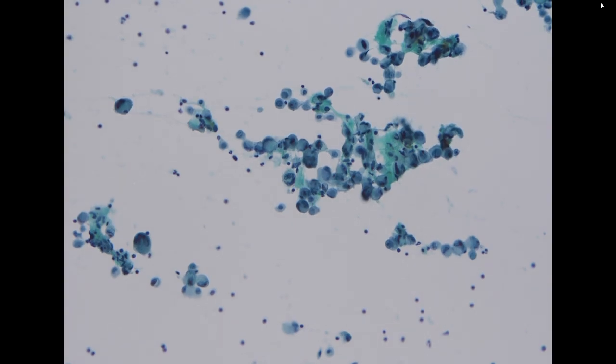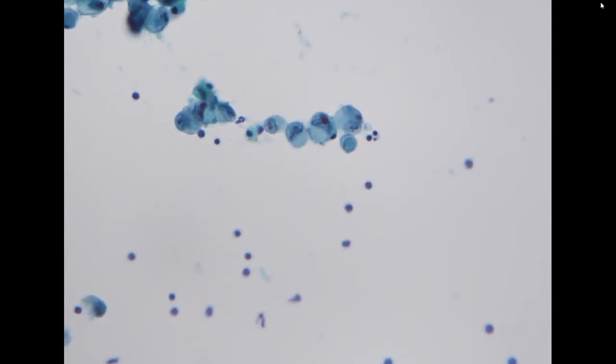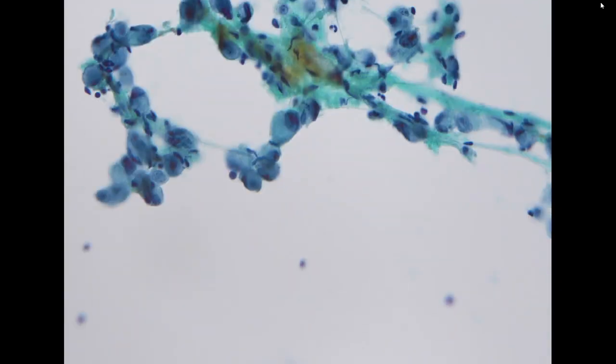So in this specimen, we see most of the cells are loosely cohesive or single cells, and there are prominent signet ring cell features from here to there. Occasionally, primary pancreatic cancer can also have signet ring cell morphology.